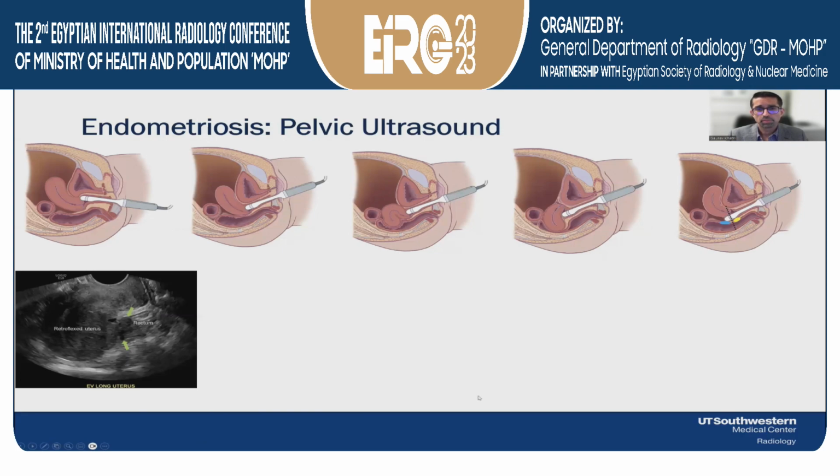Now, moving on to pelvic floor ultrasound or pelvic ultrasound for endometriosis. This may be something that you are doing at your institution. We're about to implement this at ours. Most of the images and schematics I have here, again, are from the Abdominal Radiology special issue on endometriosis from 2020.